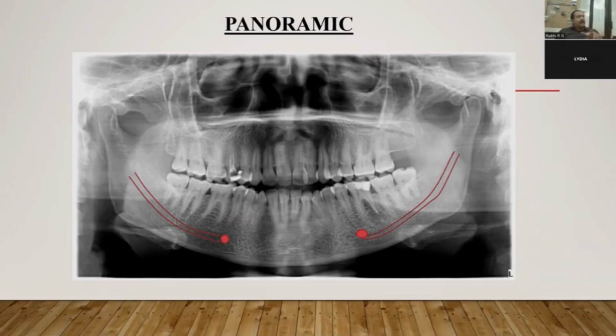So when a tooth connected to an implant are staying wide apart, a small effort, a small bite on the tooth, will make it sink around 28 microns into the socket. That will naturally result in uprooting the implant. Now, what does that mean? As the effort and the resistance come closer, it will be difficult to uproot it. The natural crowbar, effort, resistance, and fulcrum principle. So when you have the implant to tooth connection closer and closer, the implant and tooth will have more stability.